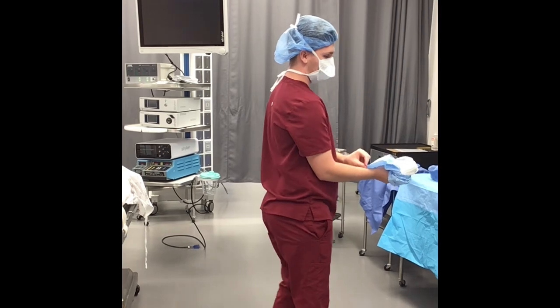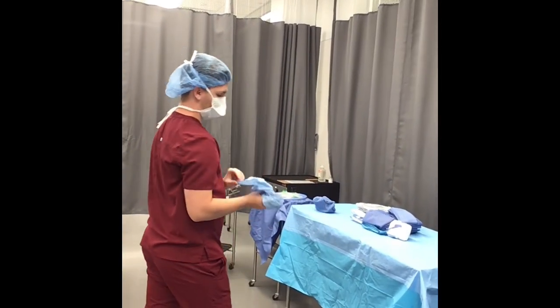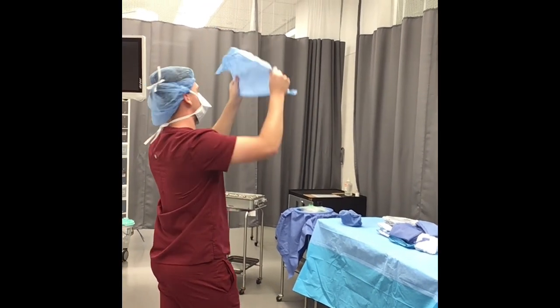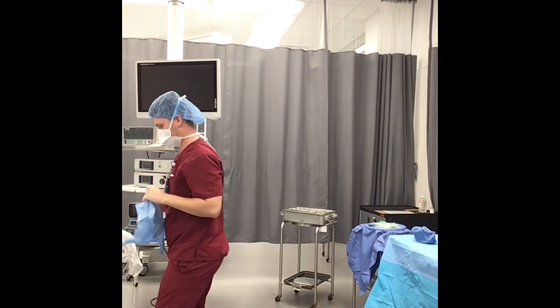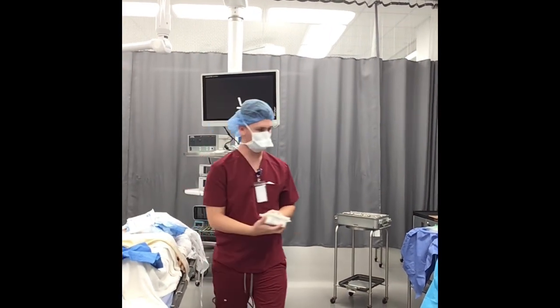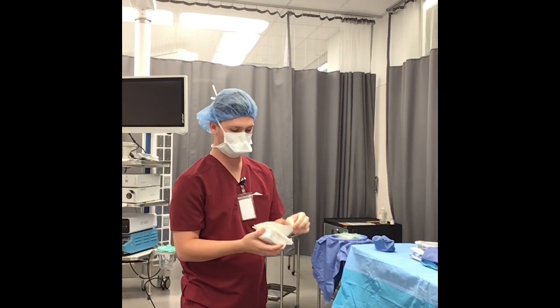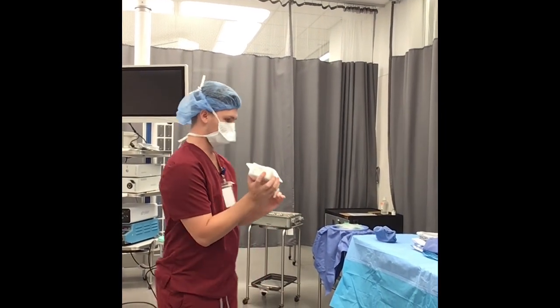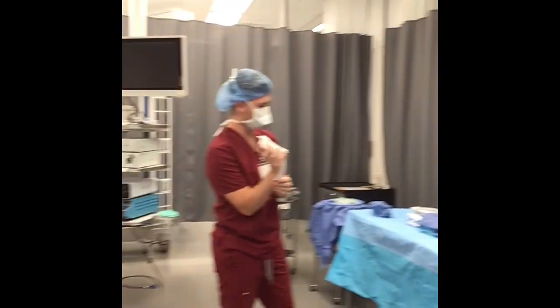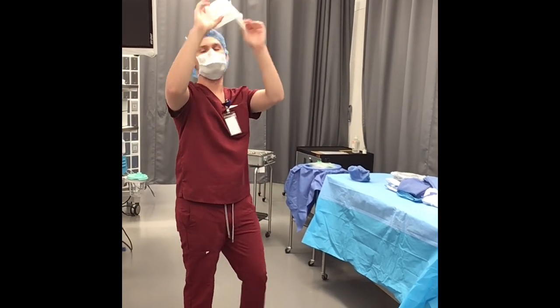Same thing here. So this can go on my back table. I'm going to maintain my distance, rock in, roll forward, and toss on. There's not much force that needs to go behind these. You don't have to really rock it on there. Okay, so next I have my Ratex. So I'm going to peel this package open, and then I'm going to shoot this on. Same concept: rock back, rock forward, and shoot away. Check for holes. That looks good.